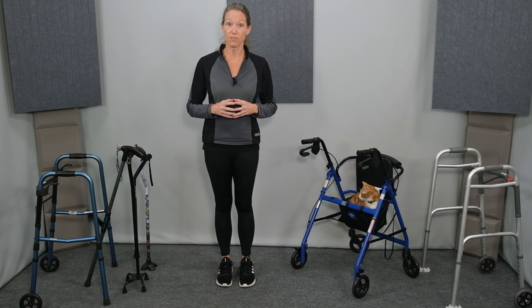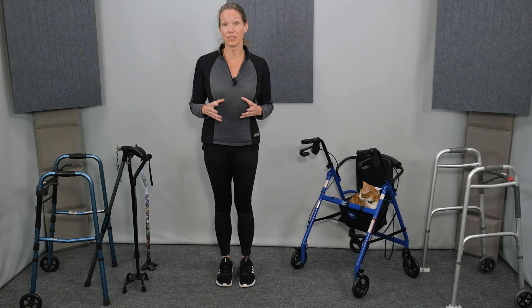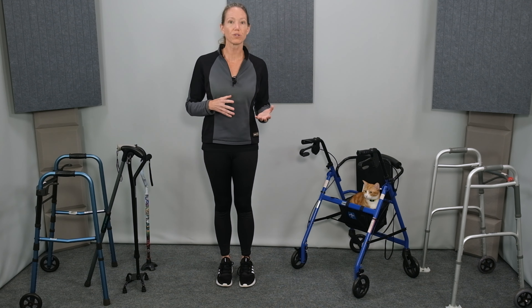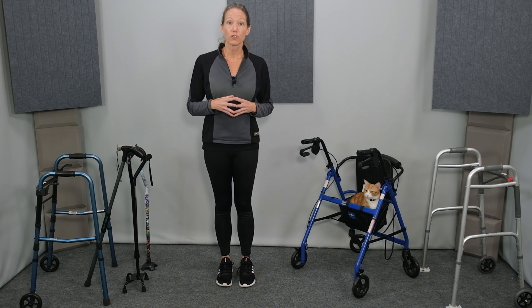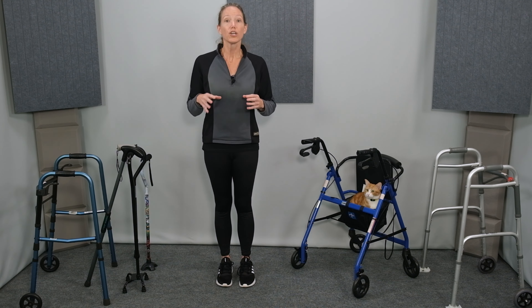Hello, I'm Beth Wagner, Physical Therapist. In this video I'm going to talk about how to choose the best mobility assistive device for your specific needs. I'll be covering canes and walkers. There are a couple main factors to consider when choosing an assistive device: how much support is needed and how will the device be used? Is this for temporary or long-term use? Is this for short, medium, or long distance in the home and/or in the community? And what is the individual's baseline strength, endurance, coordination, and balance?